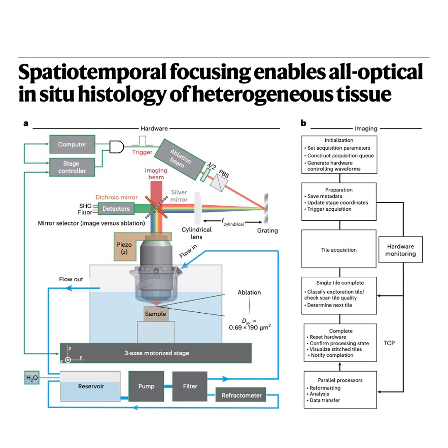Quality control. Yes, and that's where the explore step comes back into play, but in a different way. After an ablation step, the system often performs another quick explore scan of the newly cut surface. To check its work. Exactly. It uses that low-res image for ablation quality control. The analysis software looks for any signs of residual tissue that should have been removed. And if it finds some, does it just flag an error? No, it tries to fix it automatically. If residual tissue is detected, the system halts the normal workflow progression and re-enters the ablate mode specifically for refinement to target those missed spots.